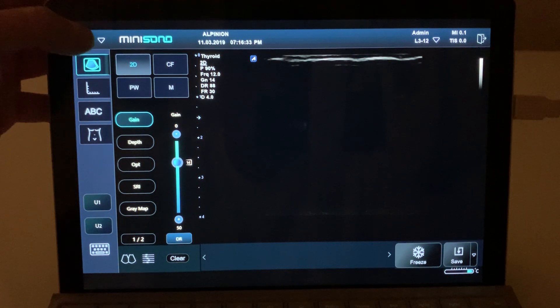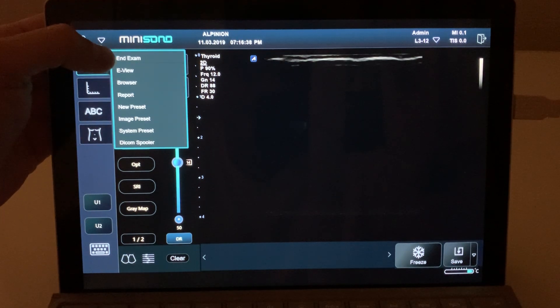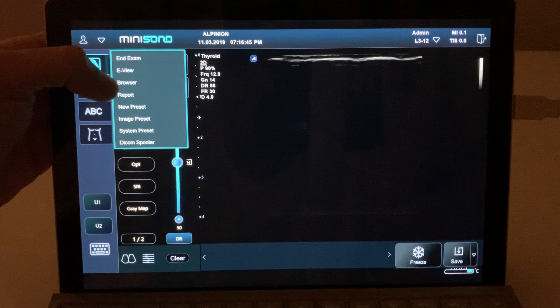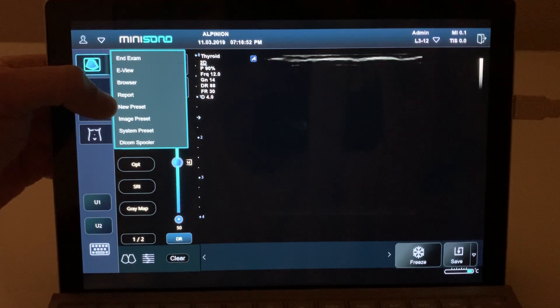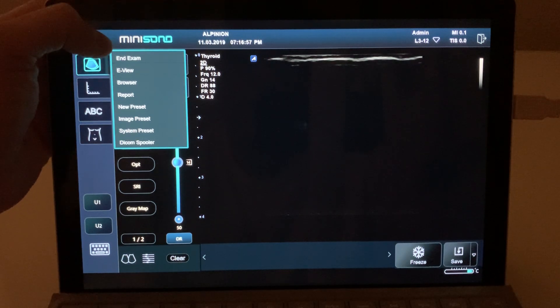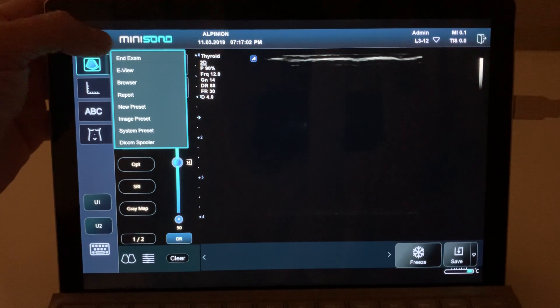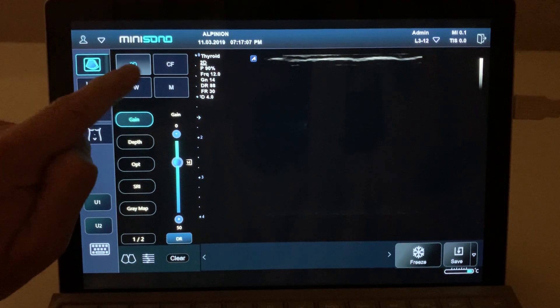In the next arrow here, this little icon shows different options. One important one is the exam, and the browser option — browser is where we can access all the patients we have in the system memory. We also have report, where we can see the measurements we did in the study. The most important things will be exam, browser, and report. If you click here again, it will disappear.